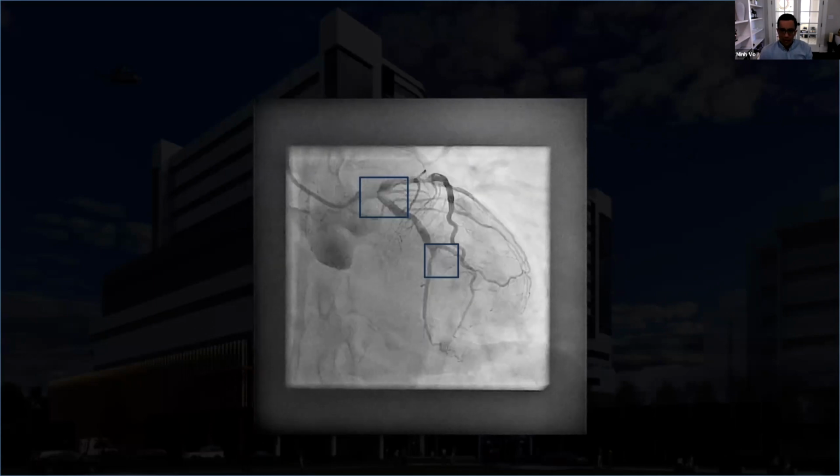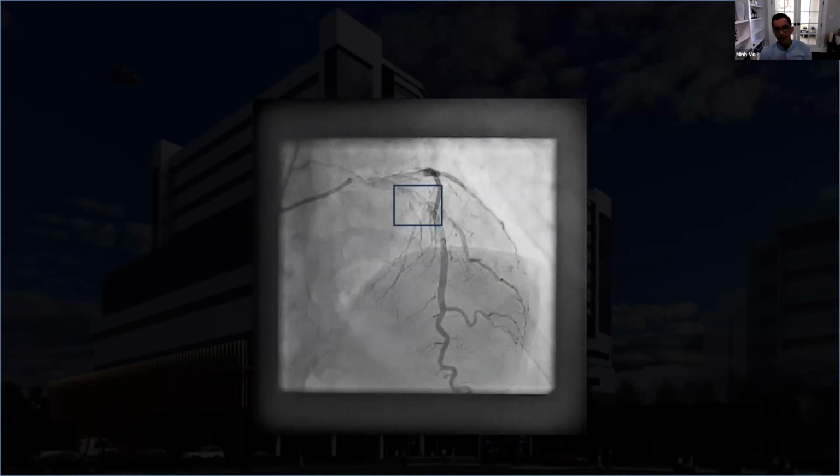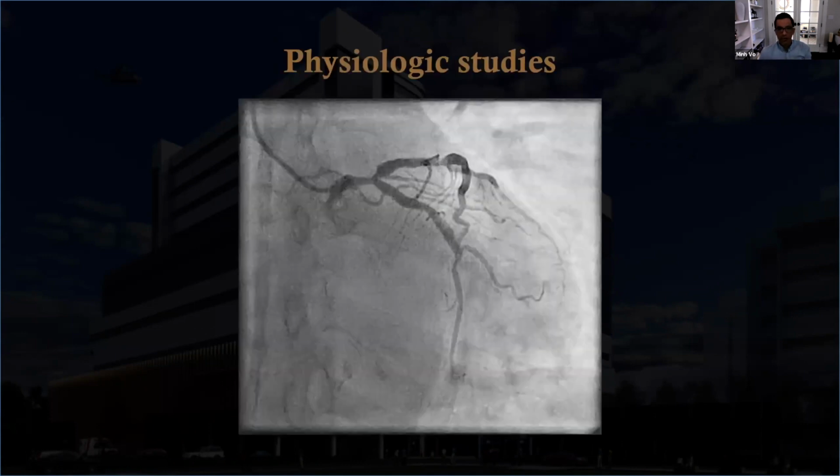I had the fellow with me and I said, you know what? Before we do anything, we really want to make sure that these are severe lesions. They look severe, but let's make sure. Before the pandemic, I would have proceeded to rebook this patient with complex PCI, and I'm being straightforward with you. Now, because of the pandemic, I'm pushed more to justify my cases. The proximal LAD lesion as well looks severe. So I said, let's do the iFR of this lesion. It's not severe. Everyone was shocked. I was shocked. We did pullback, multiple, normalization, everything, not severe. And again, I'm not a coronary physiology expert, so I was shocked. I did just the LAD into the diagonal, again, not severe.